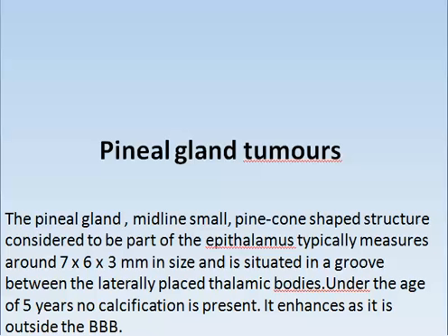The pineal gland is a midline, pine-cone shaped structure, considered part of what is called the epithalamus. It typically measures around 7 by 6 by 3 millimeters, an average of 5 millimeters, and is situated in a groove between the laterally placed thalamic bodies. Under the age of 5 years, no calcification is there. The gland enhances as it is outside the blood-brain barrier.